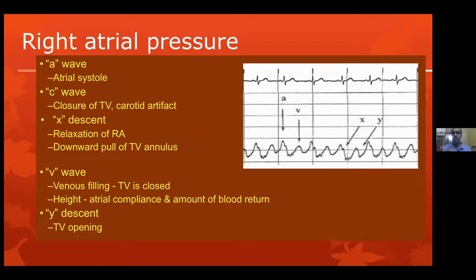Let's assume a patient with a ventricular septal defect or a PDA. Let's assume a patient with tetralogy with large aortopulmonary collaterals. Let us assume a patient with heart failure with preserved ejection fraction or systemic hypertension with elevated end diastolic pressure. You are giving an acute fluid bolus for that particular patient. There is a higher amount of blood that is returning into the left atrium, so the left atrial V waves become very tall. Second, atrial compliance.